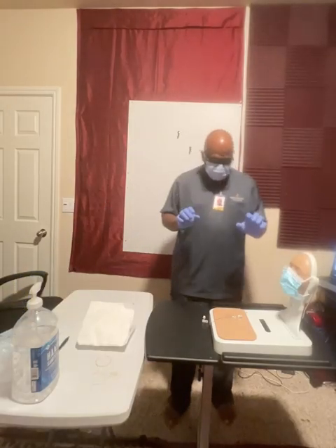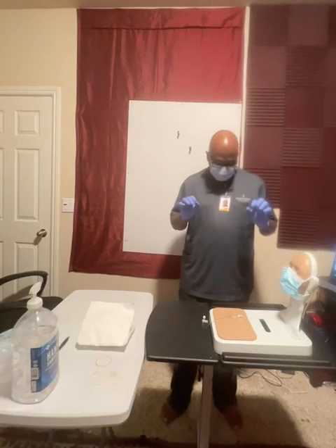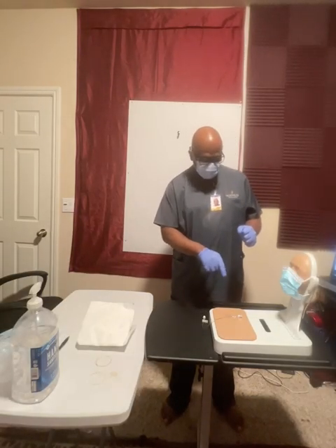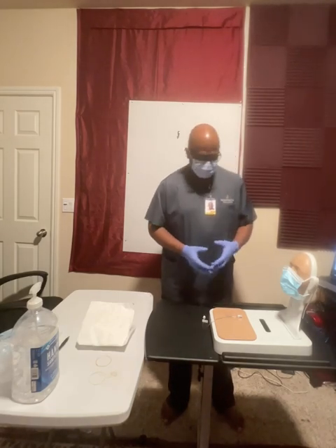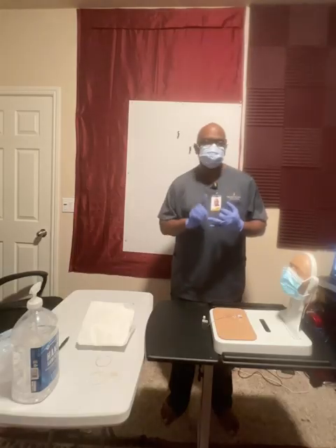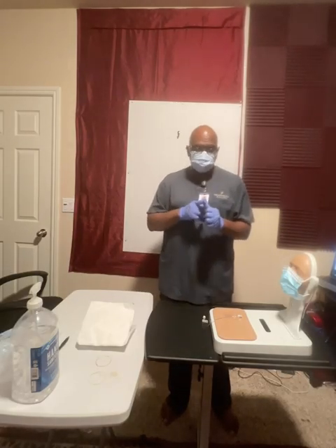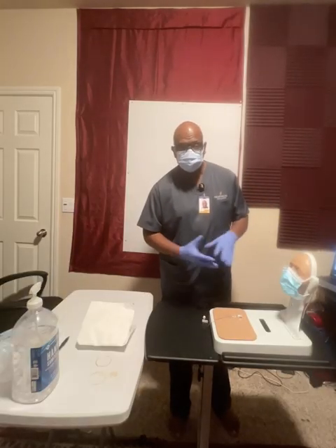Now that that's off, I'm going to be inspecting this site. I'm going to be inspecting the condition of the actual site where the catheter is going into. Also, I'm going to be inspecting the skin around the site. I'm looking for redness. I'm looking for skin irritation. I'm looking for signs of infection. I'm looking for swelling. I'm looking for drainage. I'm even using my nose to see if there's a certain smell to it, right?